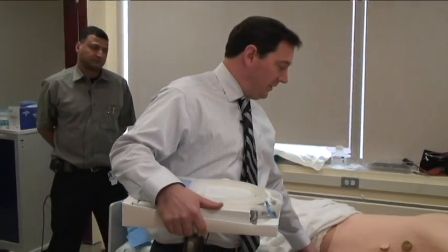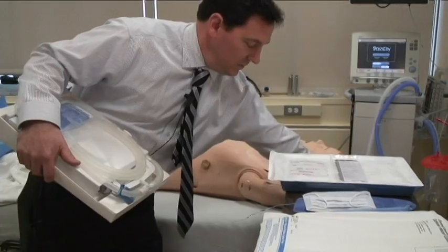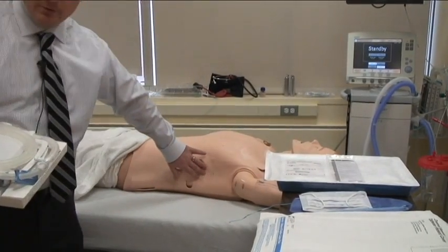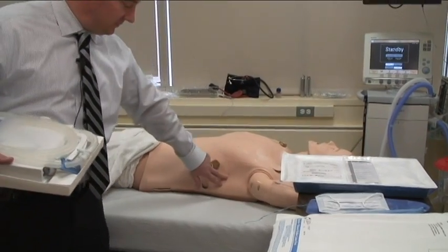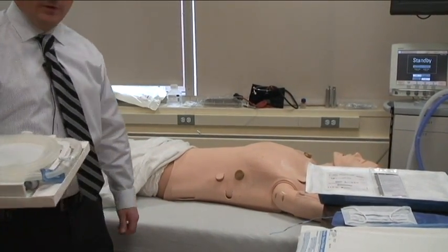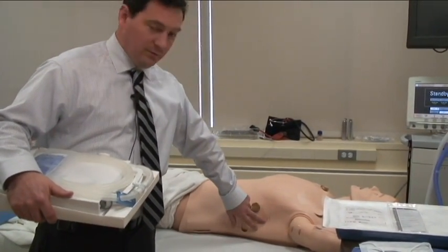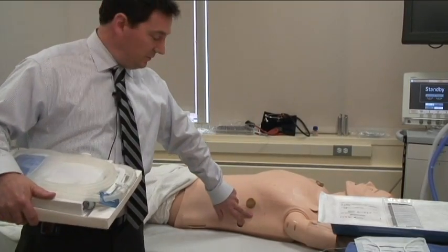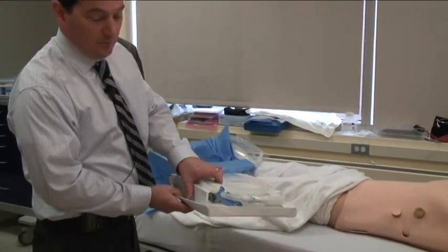Also, I will position the patient for this procedure with the arm up over his head to give me access to the mid-axillary line in the fifth or sixth, even the third or fourth intercostal space, depending on the location of the effusion or pneumothorax that we're attempting to correct. So this will be our area of interest here in the mid-axillary line. So first things first, let's set up our pleural vac so that we're ready for the procedure.